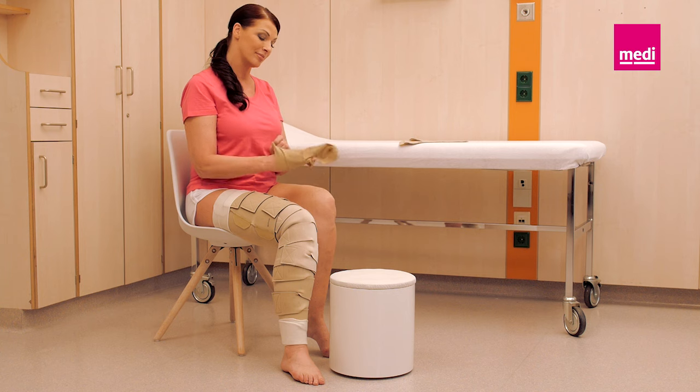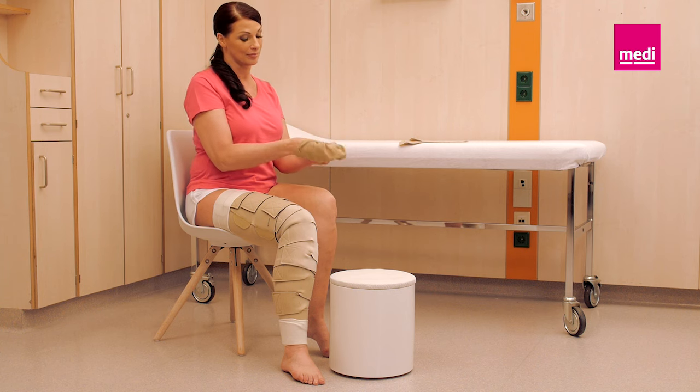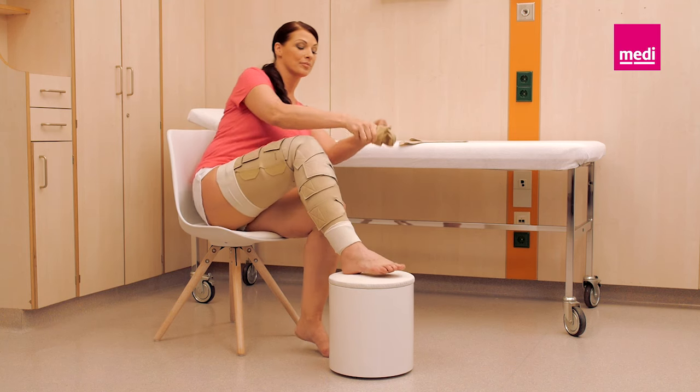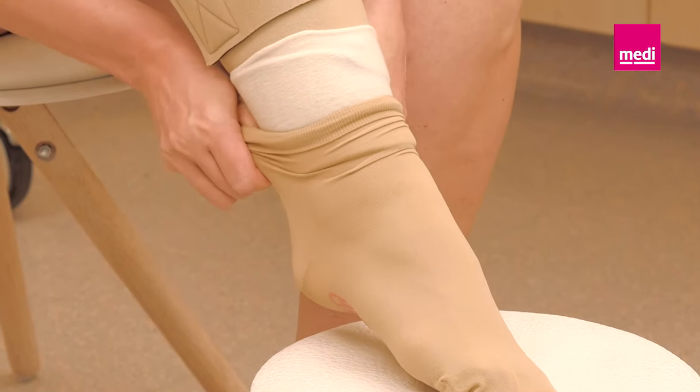Apply a circade compression anklet first for an easier application. Slide your hand into the anklet and turn it inside out to the heel pocket. Slide the circade compression anklet onto the foot and ensure that it is pulled high enough.